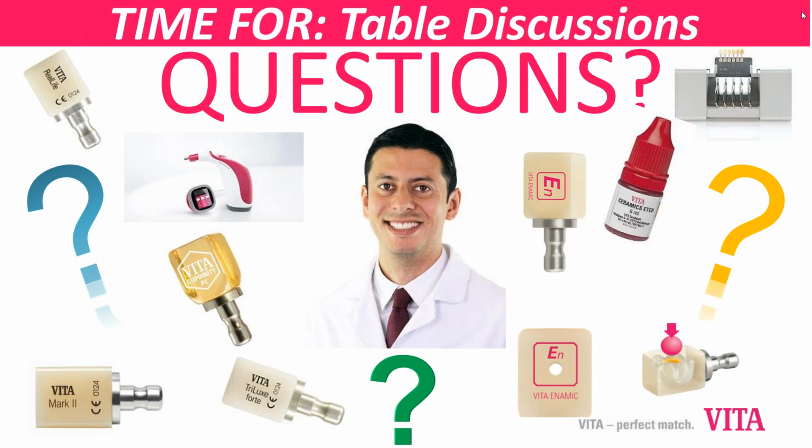It all summarizes on the attention to detail, right? We gotta have a timer. We gotta be ready. Place the hydrofluoric acid, hit on the timer, stay there. Once it's ready, start with the spray, water, air, removing it quickly, and then move to the next one. Many times, if you have, I don't know, 10 or 12 and you want to do all at the same time, I'm sure the time of etching of the last one is going to be different than the first one. So make small groups, but try to keep it within those ranges.